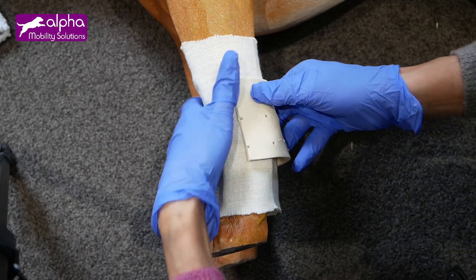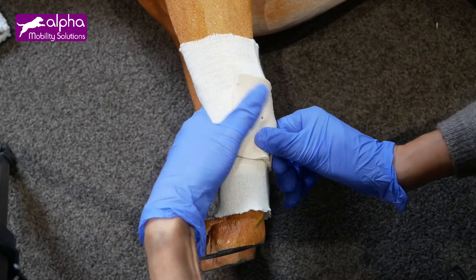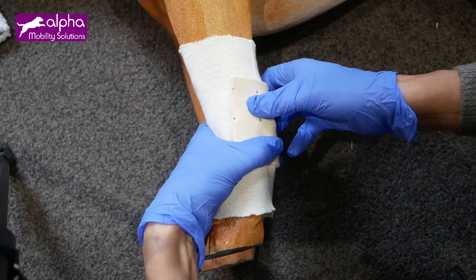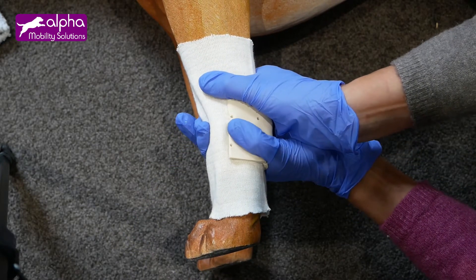Massage the area and shape the splint to the shape of the leg. You will feel some warmth from the splint, and the patient will also feel it. As it is not too hot for your hand, it should not be too hot for the patient either. Hold it in place tightly for several minutes until the splint becomes hard again.